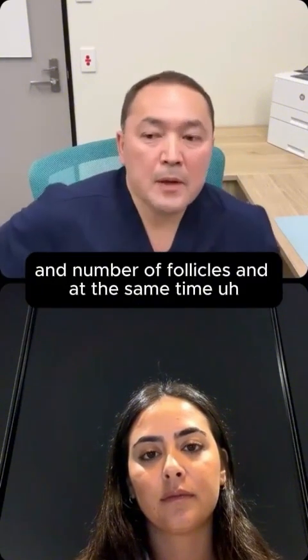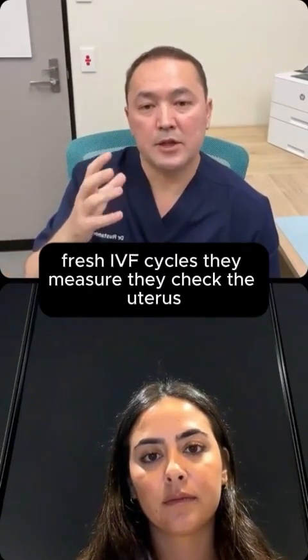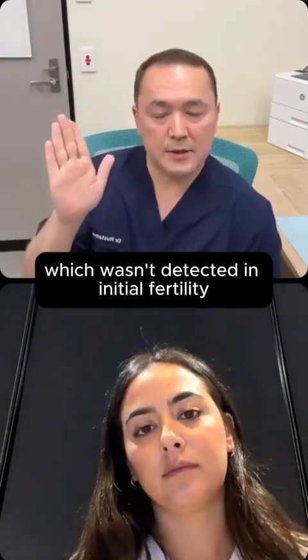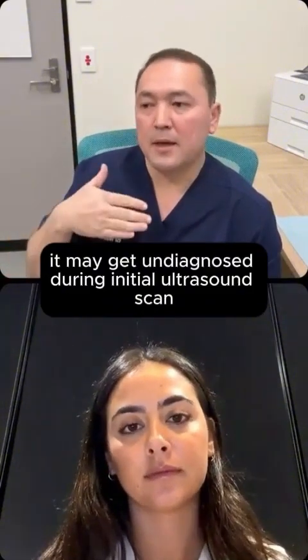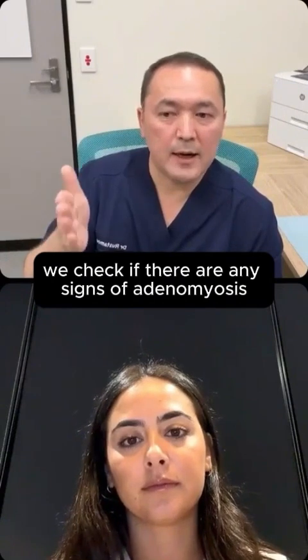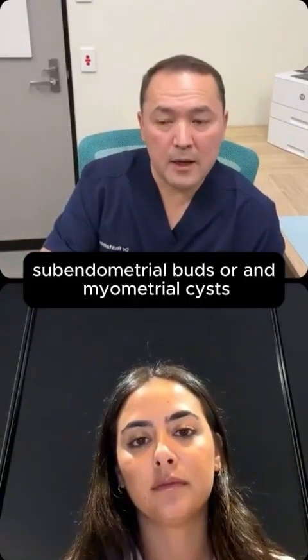At the same time, during IVF monitoring in fresh IVF cycles, the sonographer checks the uterine size and the uterine contour, because if some pathology was there which wasn't detected in the initial fertility baseline scan, we want to pick it up. Let us say adenomyosis, for example, may get undiagnosed during the initial ultrasound scan. During monitoring, we screen for adenomyosis. We check if there are any signs of adenomyosis like Venetian blind sign and shadowing, subendometrial buds, or myometrial cysts.